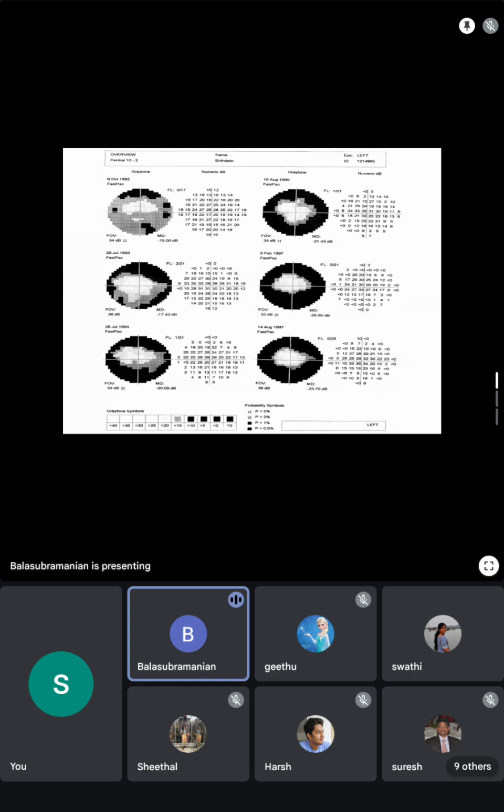Is this a regular course of a glaucoma person on treatment with us? Is it the field of a person who has been adequately, optimally treated? No. This is not the aim of our treatment. We should halt progression. For this person, the mean deviation has worsened from -15 to around -24 over a course of 5 years.